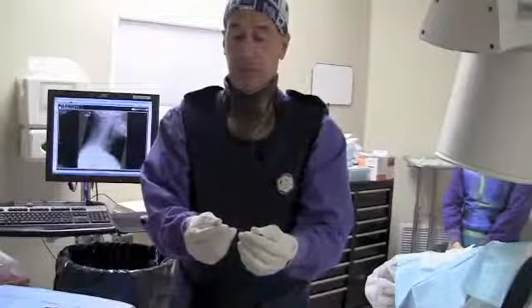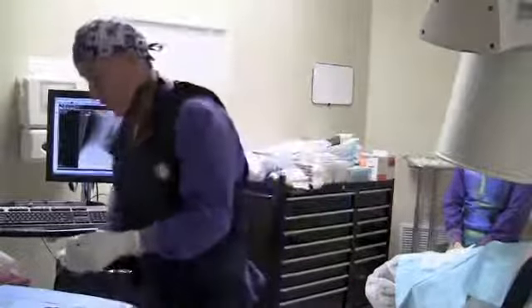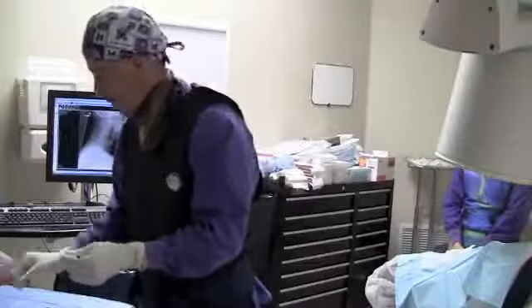The needle that we use is very, very small. That's what we're going to inject with in that area.